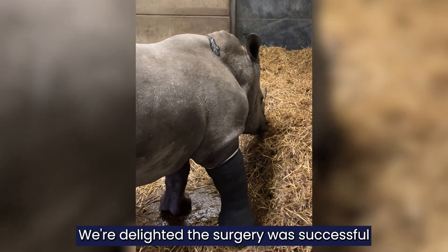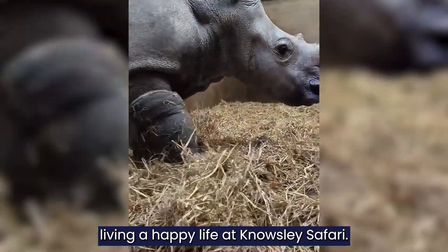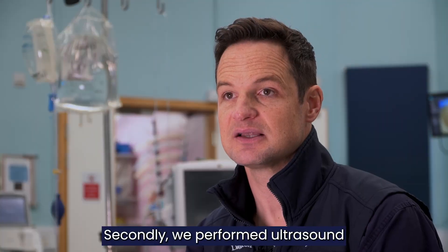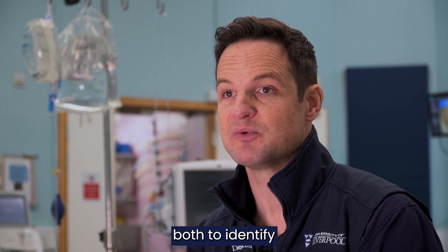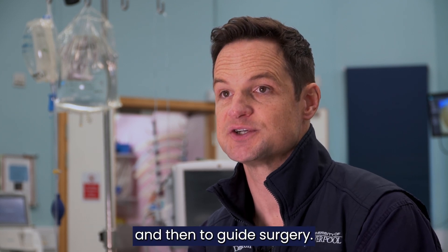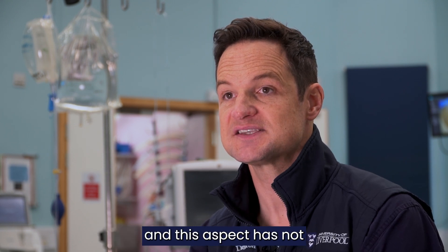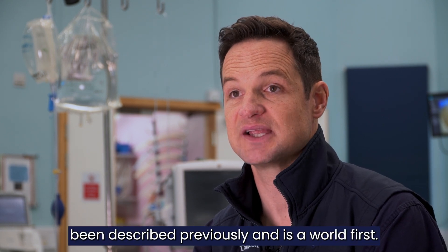We're delighted the surgery was successful and that Amara is now living a happy life at Nosely Safari. We performed ultrasound both to identify the fracture plane, the fracture fragment, and then to guide surgery. This ultrasound-assisted surgery has not been described previously and is a world first.